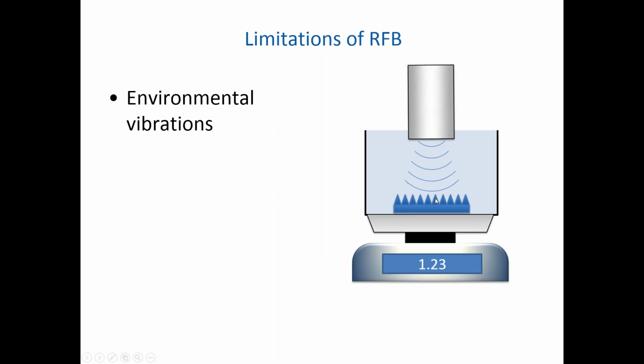and therefore not all of that is recorded as a power. We may have a situation where our radiation force balance is too small, in which case we're not either accurately absorbing, or in the case of a reflecting target, accurately reflecting all of the signal that's incident upon it, which can lead to errors.